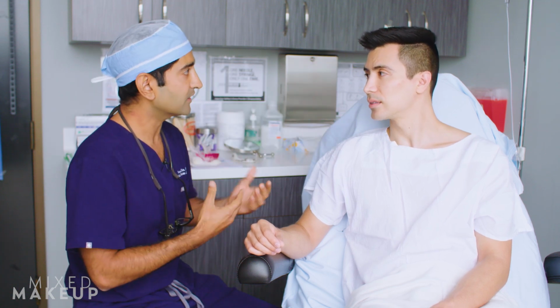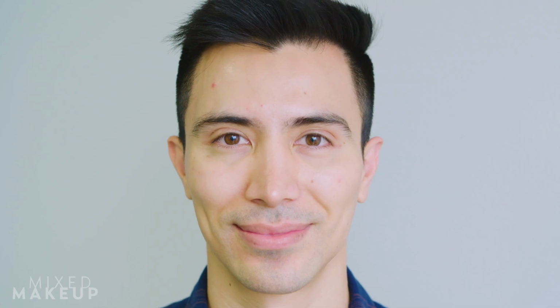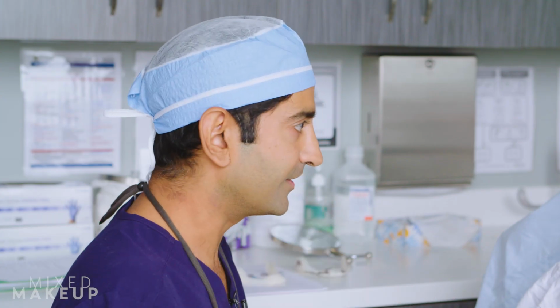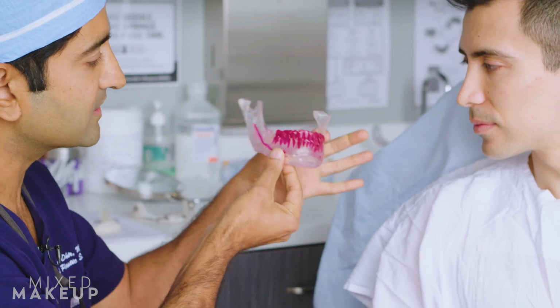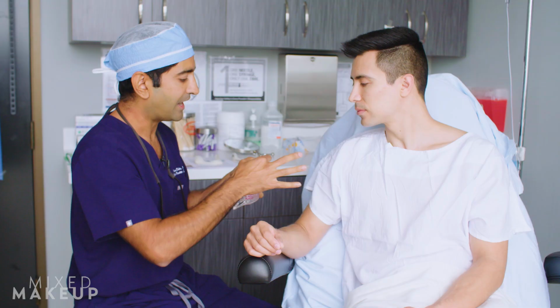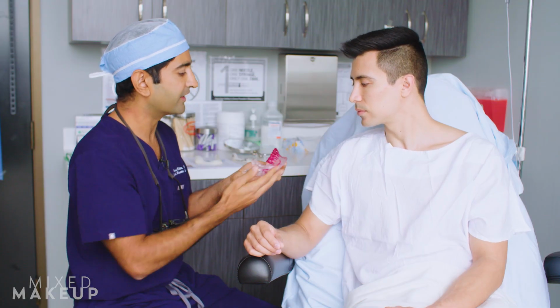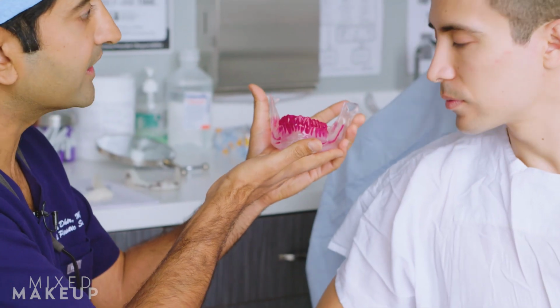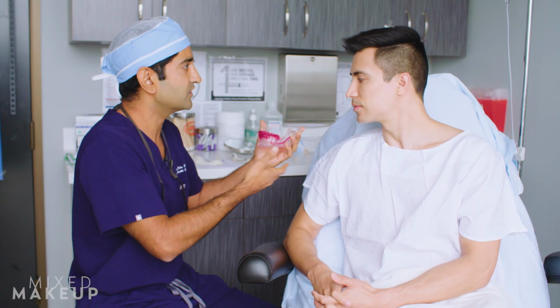Exactly. So when we first talked, I said, the top third is very well developed, big eyes, cheekbones are developed, and although it's a nice jawline, you feel that it's not in harmony with the other 2. Correct. So we got a CAT scan, as you remember, and in 3D, this was able to show everything. This is your jaw. You have an implant in place, so the computer digitally took it away, and we were able to design around this implant. It is small compared to the size and height that you have, so you were absolutely right. Anatomically, nothing wrong. It's just smaller.